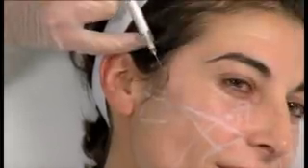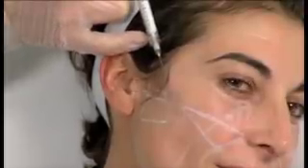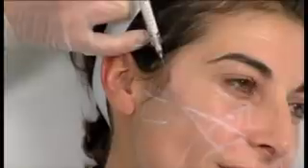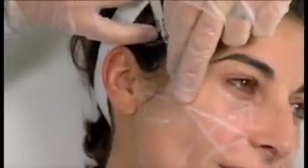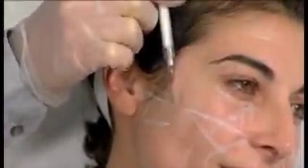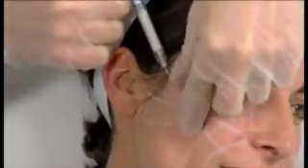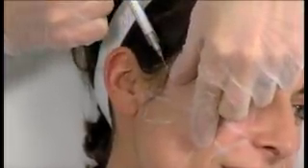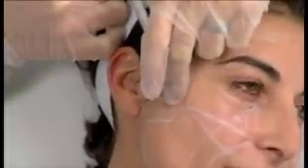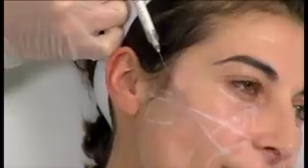Do you ever put it in the subcutis? I do put it in the subcutis, but a very important thing is not to put it in the fat compartments, especially around the jowl area, because if you inject Radiesse into the fat compartments and not above the fat compartments, then it will make the fat compartments itself heavier, and they will have more of a tendency to go down. So if you want to inject in the fat compartments, it should be in the fat compartments that have lost volume over time, like the deep medial fat compartment. You can inject there. You can inject in the deep medial fat compartment.